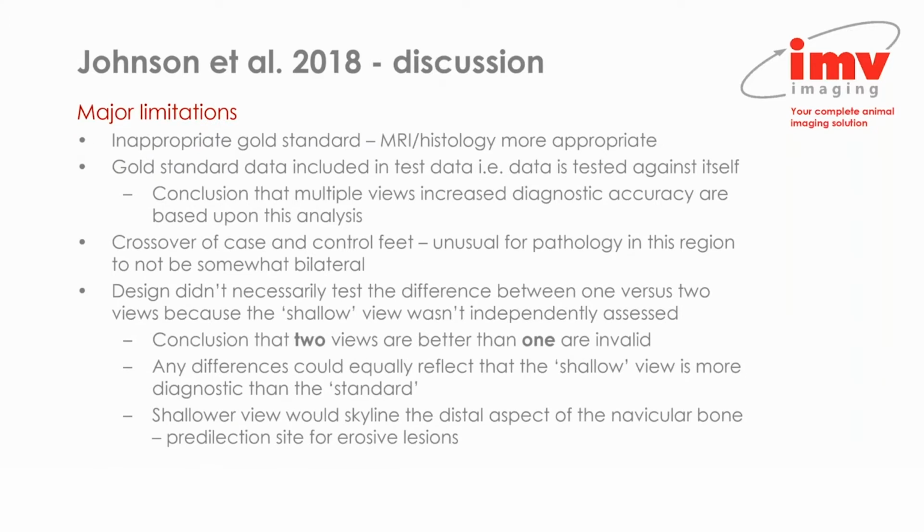In addition to those briefly alluded to, this study does have some pretty major limitations. So the gold standard, I think, was inappropriate. MRI or histology would have been a much more appropriate gold standard for comparison.